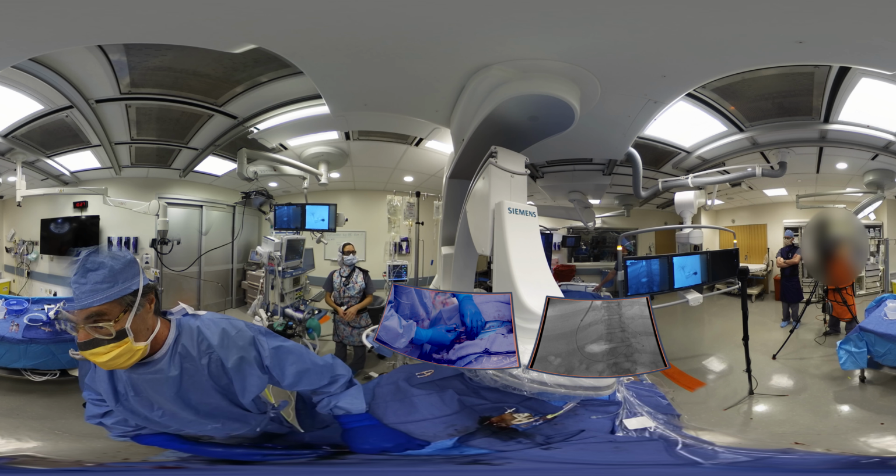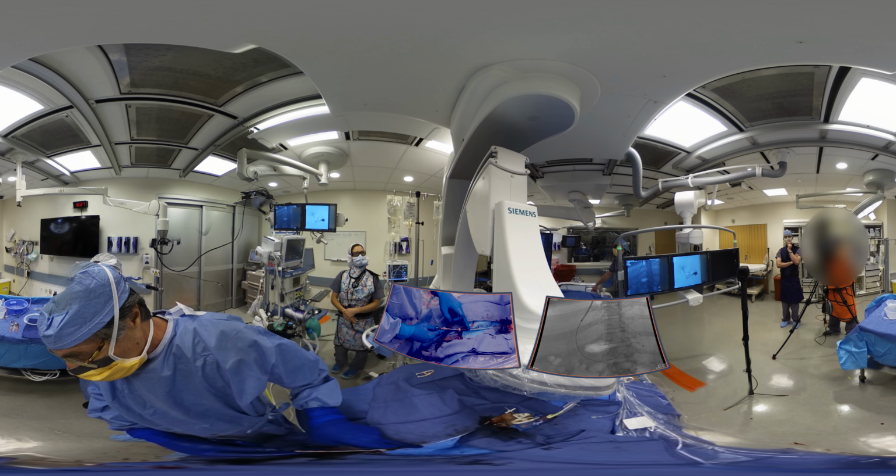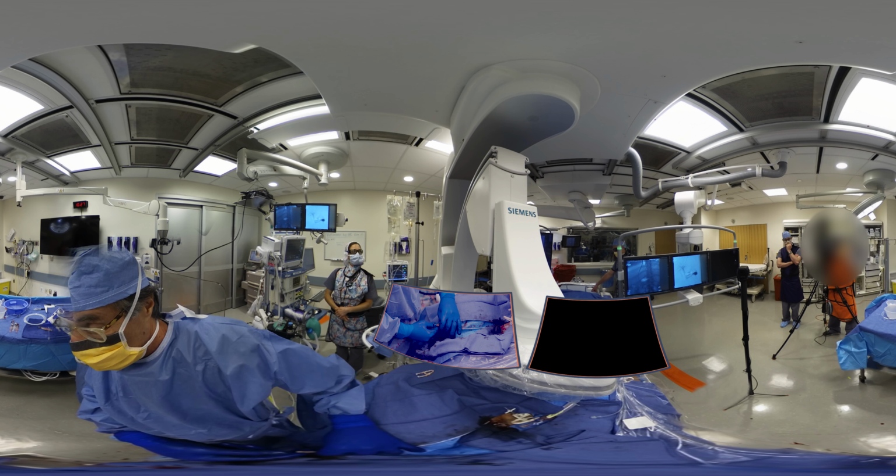So we're going to do our ballooning. The first thing I did was bring the Colapinto sheath back into the outer sheath, so I don't have to have the risk of inadvertently dilating that sheath, which doesn't have a radiopaque tip.